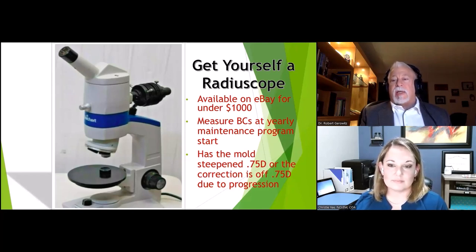It's also a good idea to get your patients in the habit of bringing their molds to every appointment to allow for mid-year deep cleaning and end-of-the-year base curve measurements.